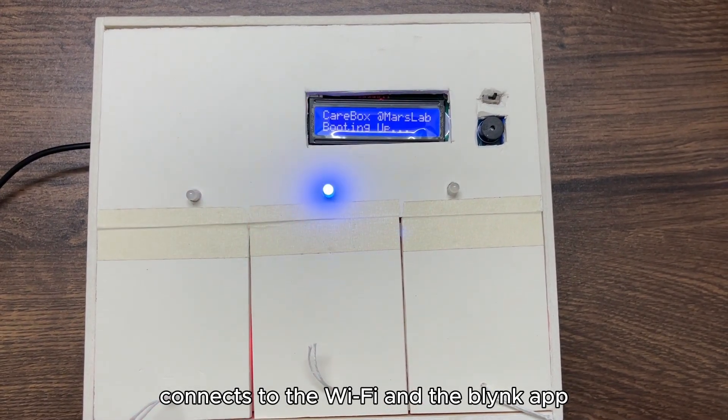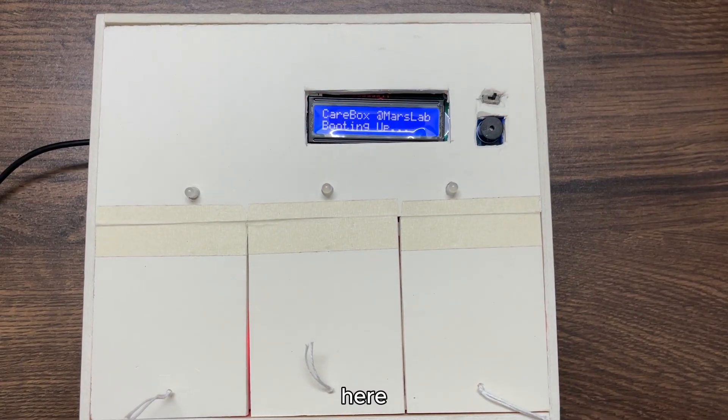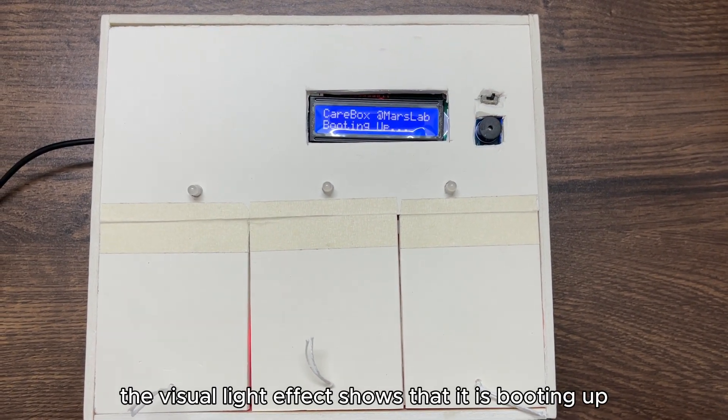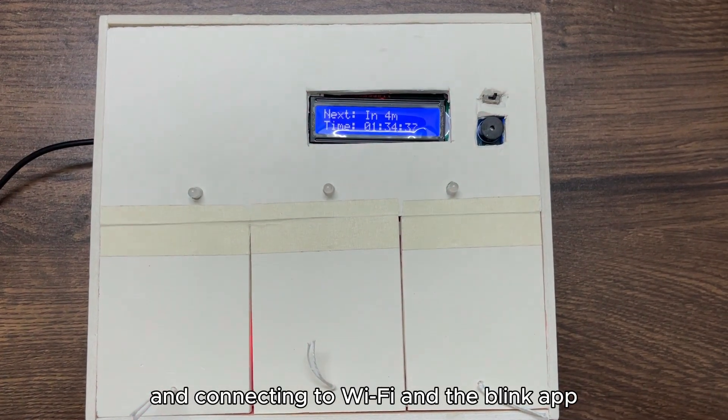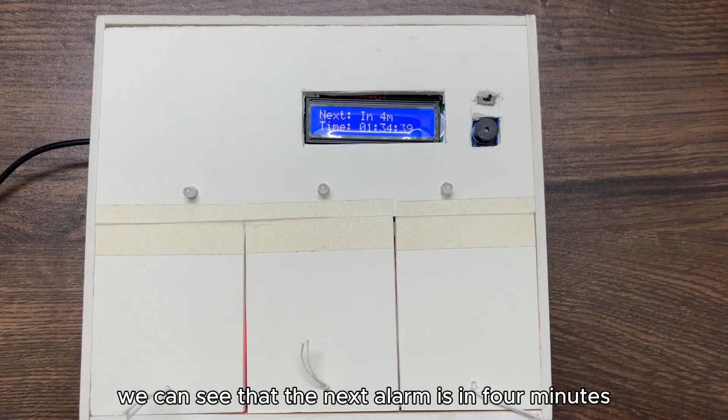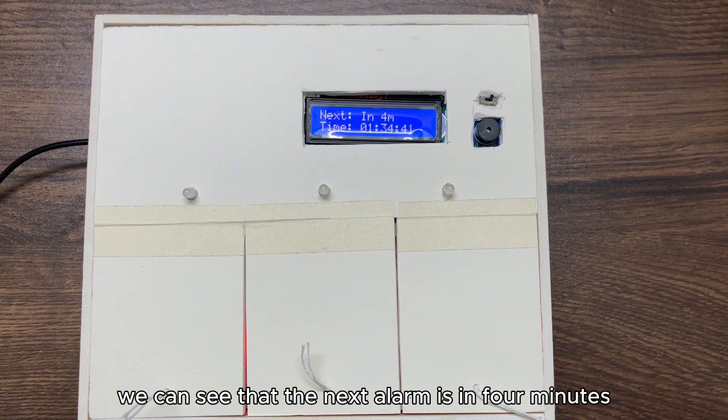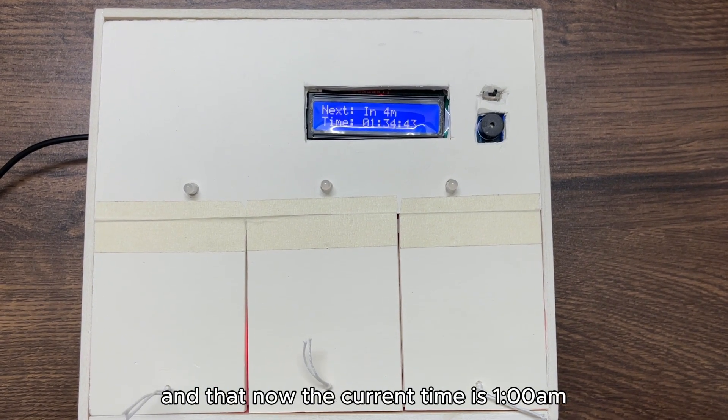Connects to WiFi and the Blynk app. The visual light effect shows that it is booting up and connecting to WiFi and the Blynk app. We can see that the next alarm is in four minutes and now the current time is 1:34 AM.